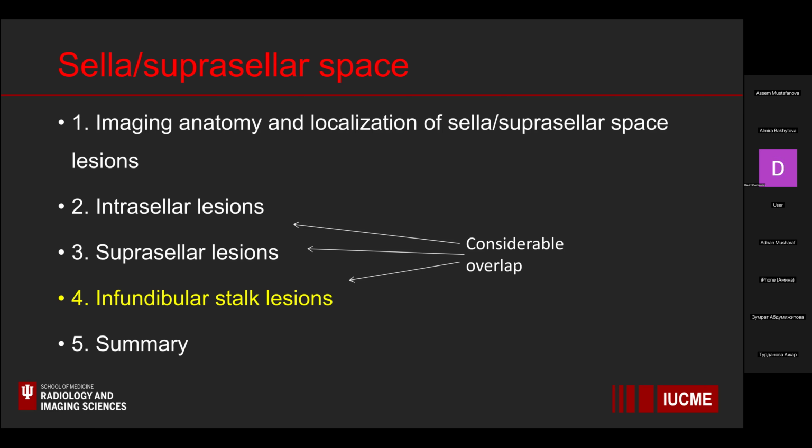As you know, there's so much susceptibility and inhomogeneity in the magnetic field because of the air in the sinus that you really struggle to get any useful information from perfusion. In fact, for the same reasons, diffusion may not be very reliable just because you have so much artifact from the aerated sinus. Thank you.